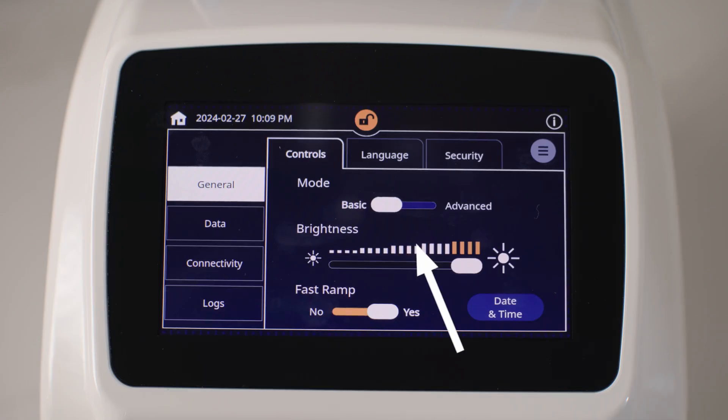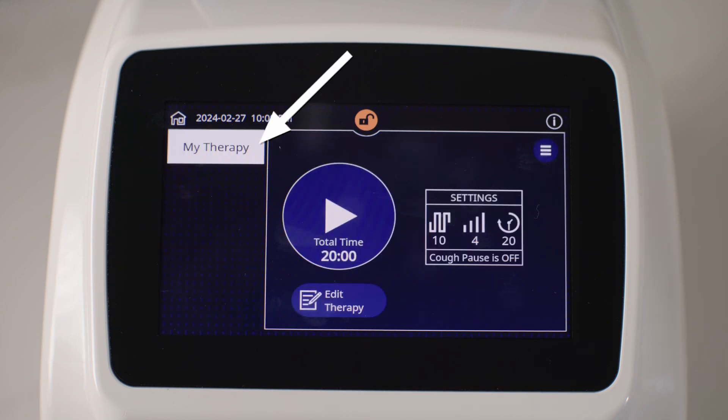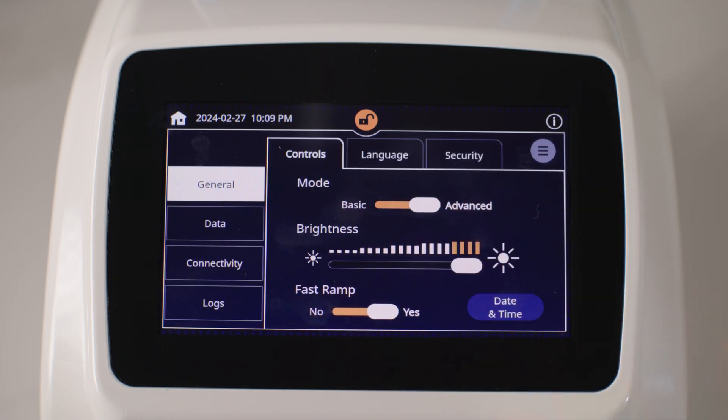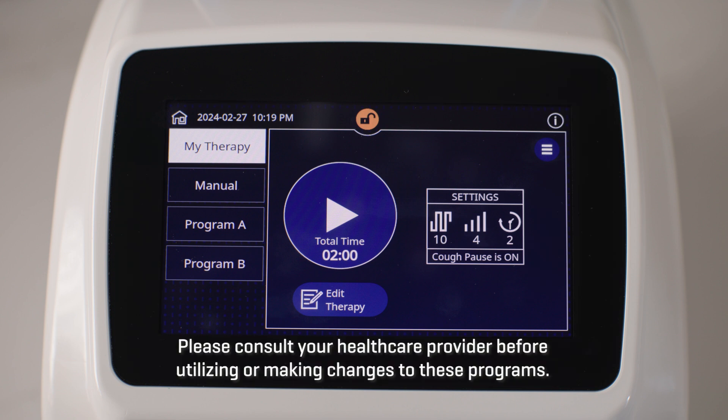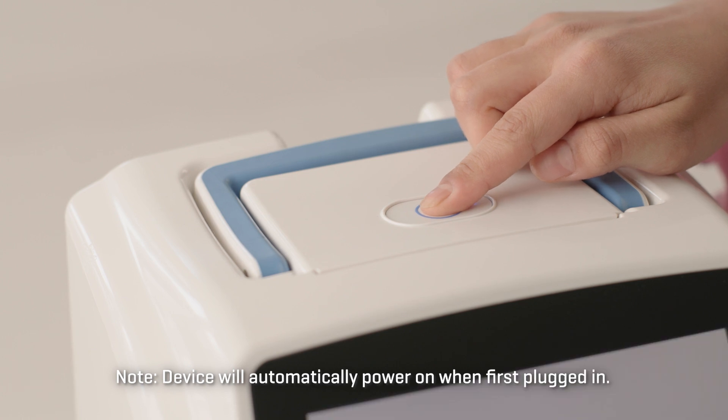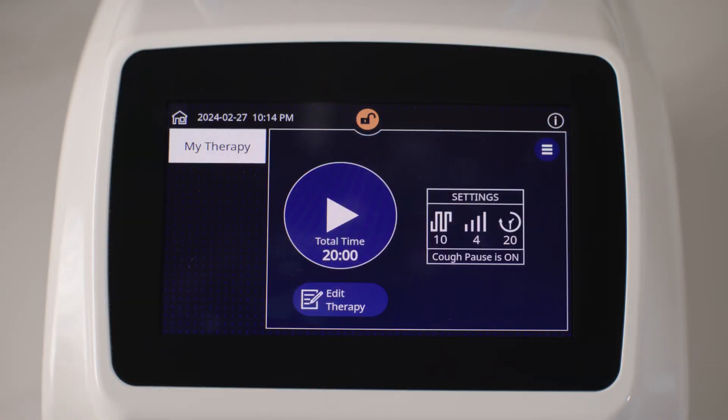The Vest APX system can be used in Basic mode and Advanced mode. With Basic mode, only one therapy program is available — by default, it is the My Therapy program, which consists of a personalized programmed therapy setting. In Advanced mode, you'll see additional programs. The devices are shipped with pre-programmed default protocols. Please consult your healthcare provider before utilizing or making changes to these programs. See the Vest APX system instructions for use for information about enabling or disabling Basic mode.